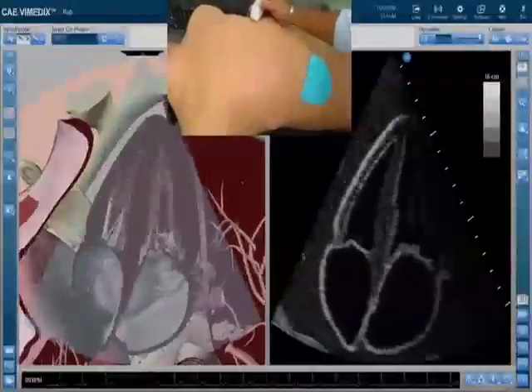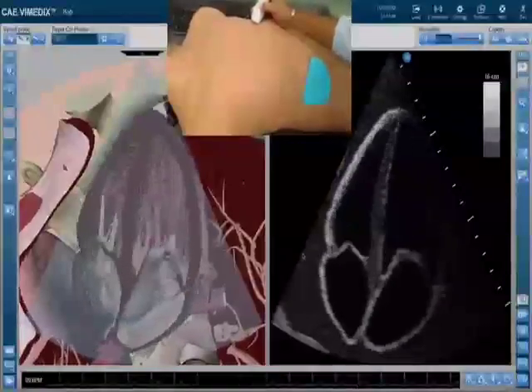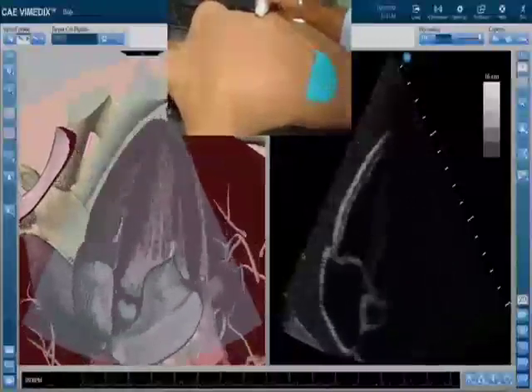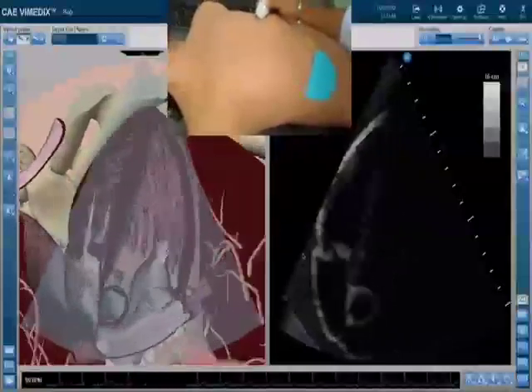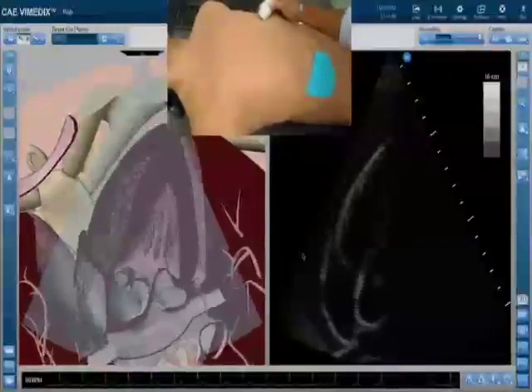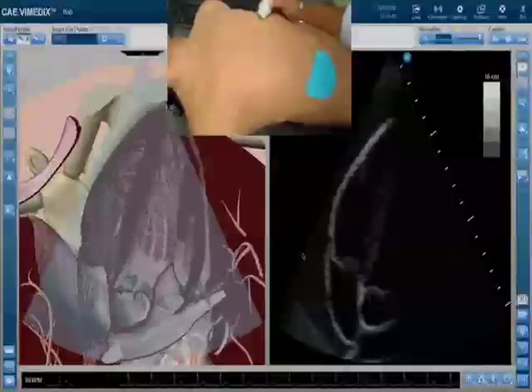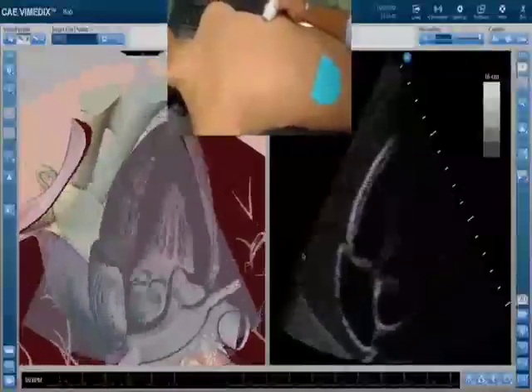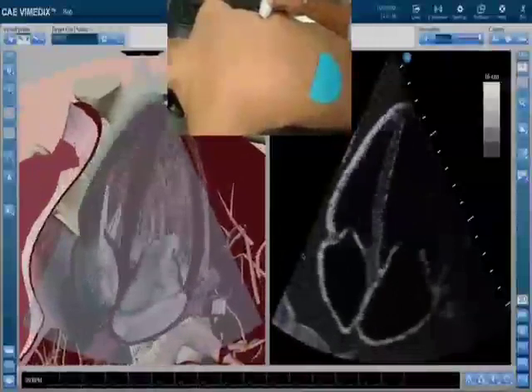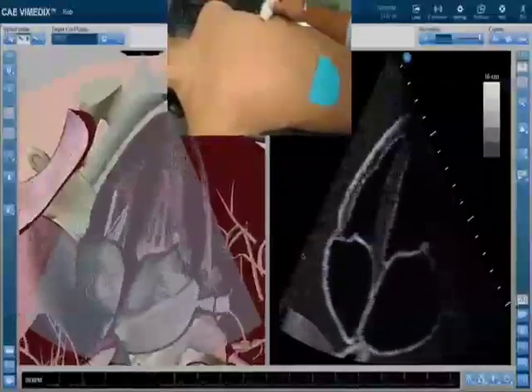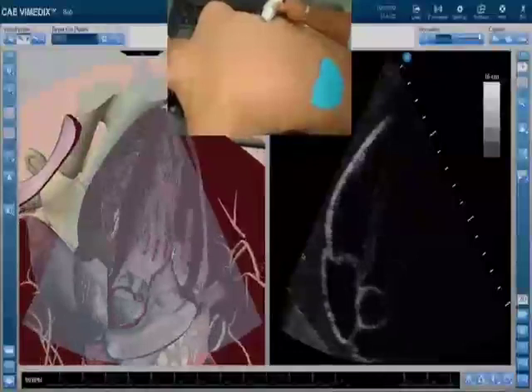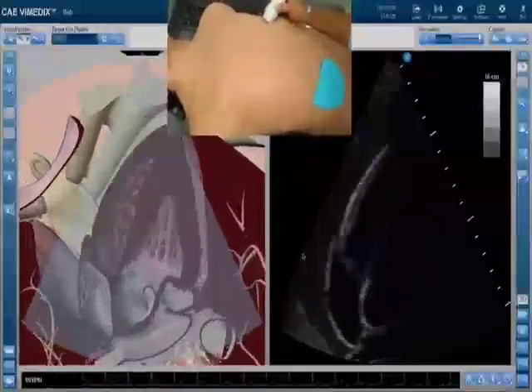To go from the apical four-chamber view to the apical five-chamber view — opening up the left ventricular outflow tract — lower the angle of the ultrasound probe with the skin. By doing that, you open up the LVOT to get the aortic valve. The indicator is still aiming at the 2 to 3 o'clock position, but the lowered angle gives you the five-chamber or LVOT view. The four-chamber view is the ideal view to Doppler and evaluate mitral and tricuspid valve function, and the five-chamber view is ideal to identify flow patterns across the aortic valve.